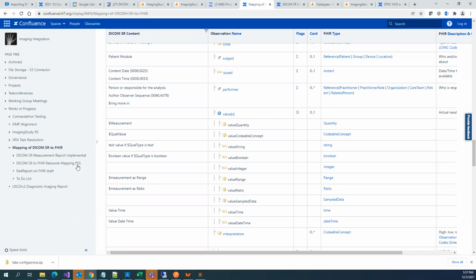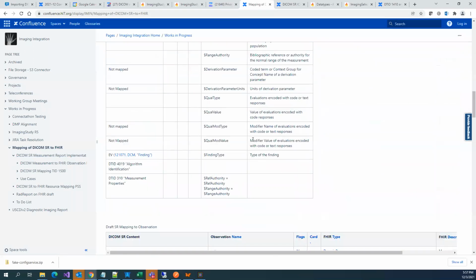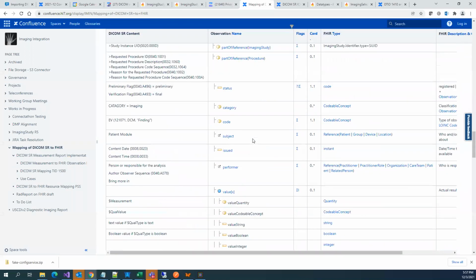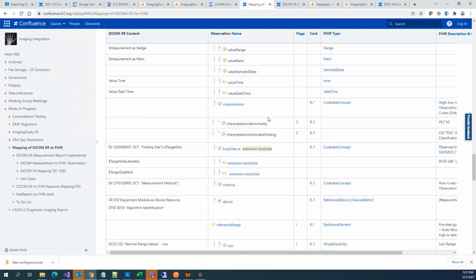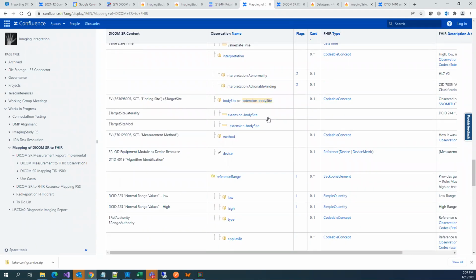Okay, so let me go a little deeper into this, just to indicate what you should do. This is at high level. Please go through this one. We will map this to an Excel sheet where it is much easier to read.